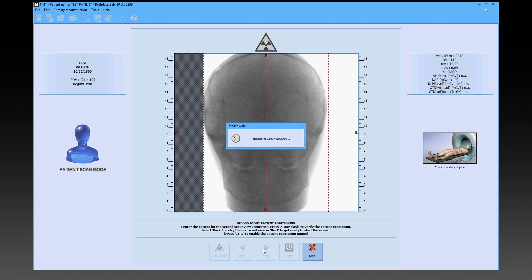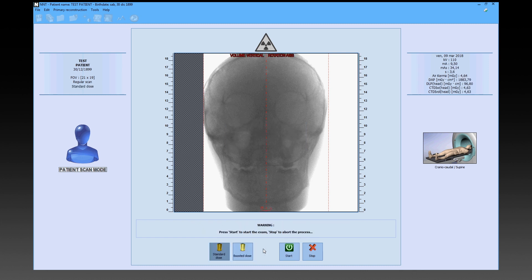Before starting the scan, a window is displayed on the PC showing a waiting status. Below the latest scout image, the physician will find two scanning options: standard dose with standard radiological parameters, and boosted dose. The boosted dose increases the X-ray load and improves image quality if the patient is edentulous or has few implants, fillings, or crowns.